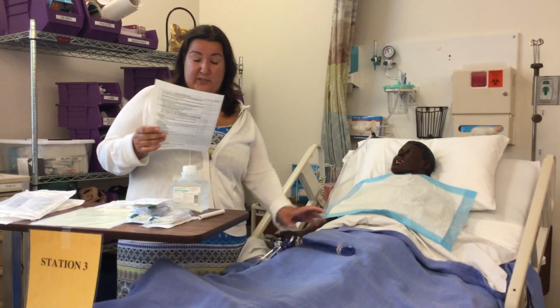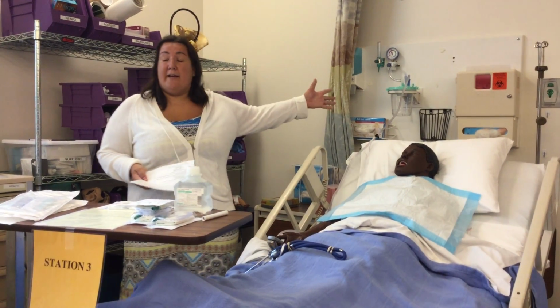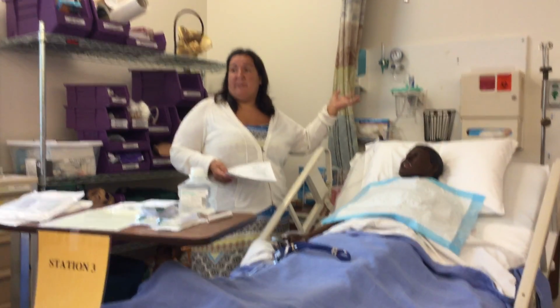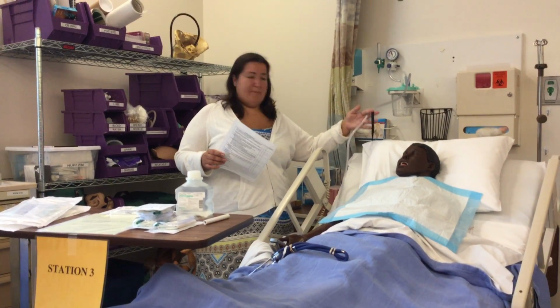Stethoscope, because you're going to assess your patient. You want to see how they sound before and after. You want to make sure you have the canister set up, because sometimes these are not automatically set up in the room. You want to make sure it's all been set up for you and that you have it going. Sometimes they might have them in the room, but they might not be connected. There might not be any tubing on it.